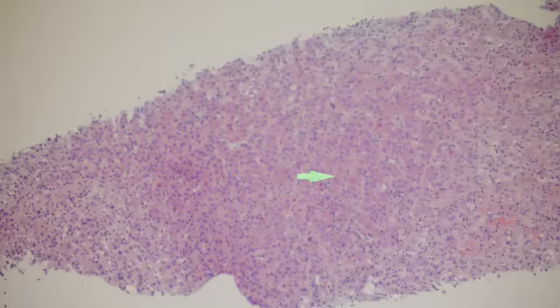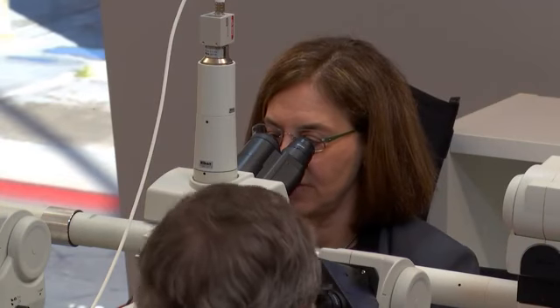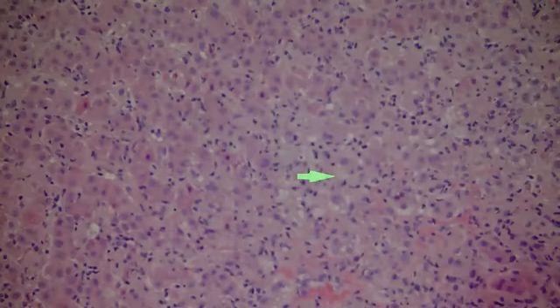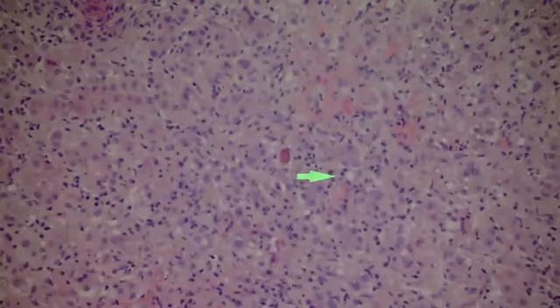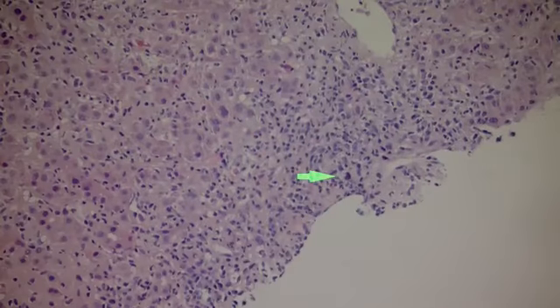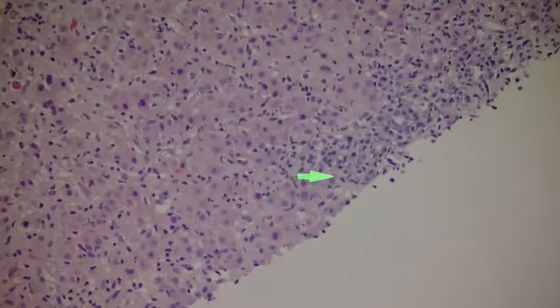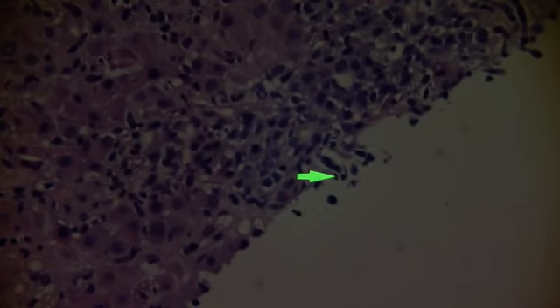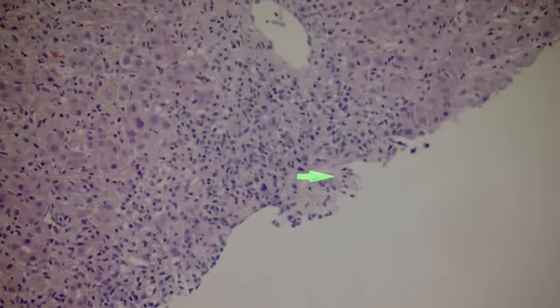So at this point, everyone's got this acute hepatitis pattern down, and lots of dead cells. You can sometimes, when it's resolving, see more of this kind of pigment scattered about and aggregates of it. Now, this one was an autoimmune that has more plasma cells. And although you could see plasma cells in things like viral hep A, when you see this many, I would absolutely mention it. I would ask for the labs, and pay attention to those.